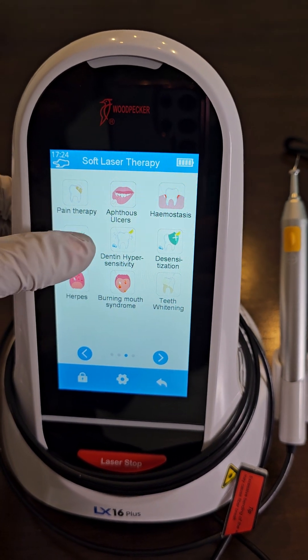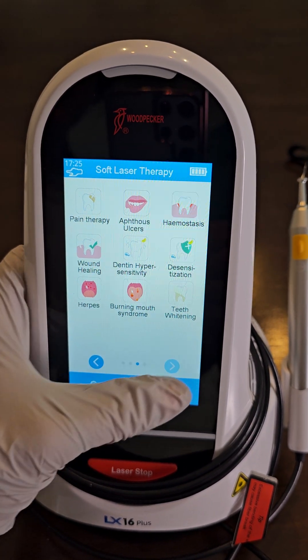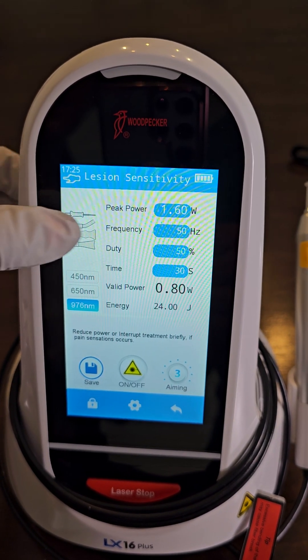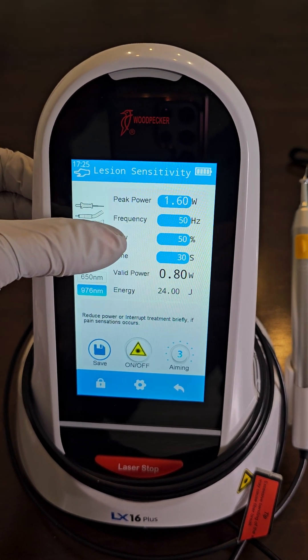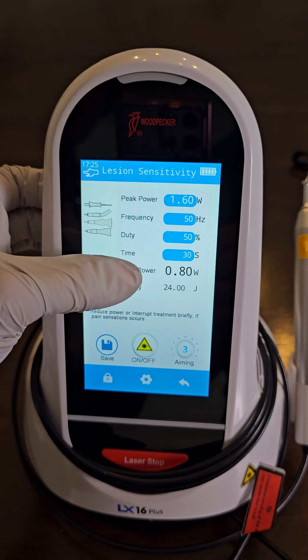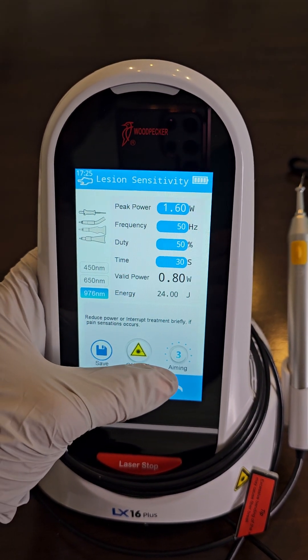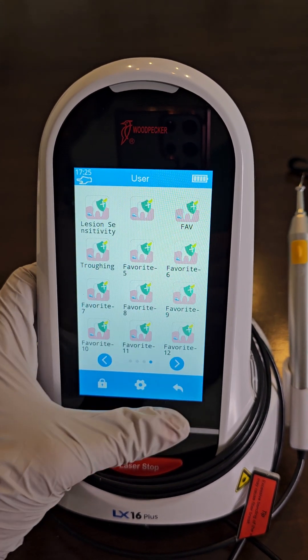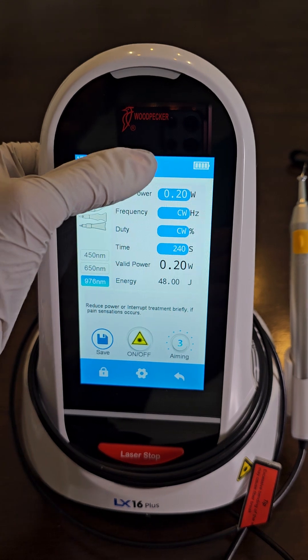Now let's program the fiber optic. I've programmed lesions and sensitivity. You can see the power is 1.6, the frequency is 50, duty cycle is 50, my 30-second timer, average power 0.8, and I have the 976 wavelength selected and 3 is my aiming beam. Now let's program LBR.